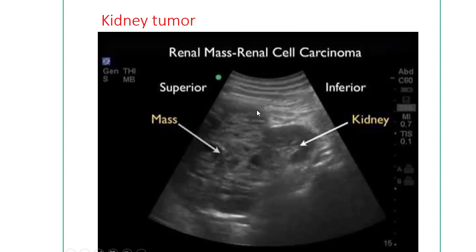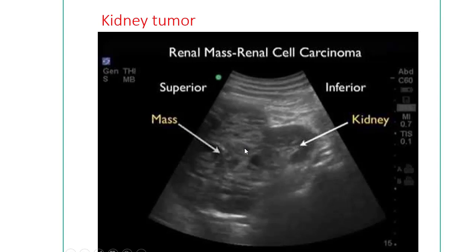This is a kidney tumor. This is the normal kidney and here is a tumor or mass arising from the kidney. The solid mass size, origin, and number can all be identified by ultrasonography, though confirmatory testing can be done by CT scan and biopsy.